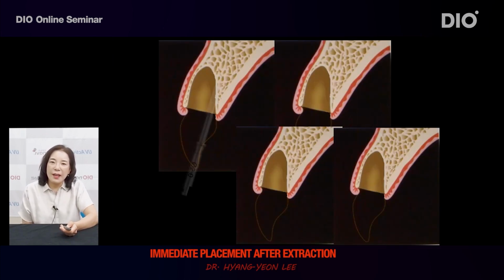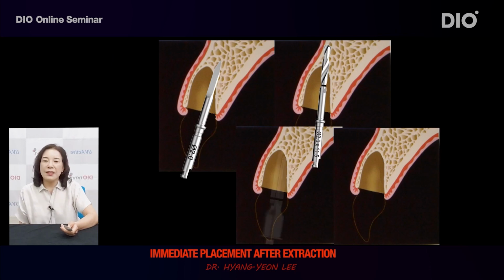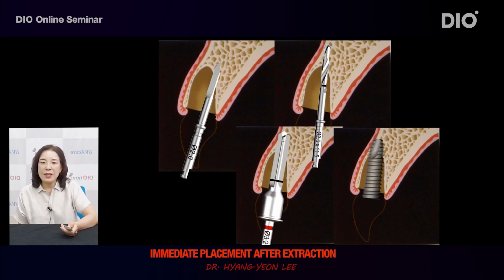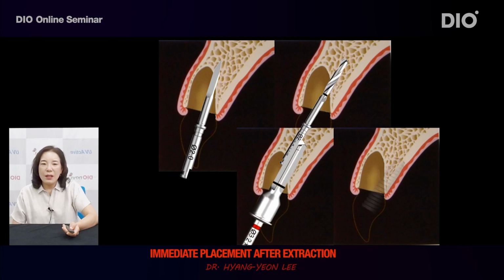Drill first in the desired direction when performing surgery without a guide. However, as you drill, there is an extensive tendency of the drill slipping towards the lowest section of the tooth extraction socket, causing the implant to be placed in a wrong direction if you are not careful. In addition, even if you drilled in the desired direction the first time, the implant can be placed in the opposite direction if you drill excessively in the opposite direction to prevent it from slipping towards the tooth extraction socket.